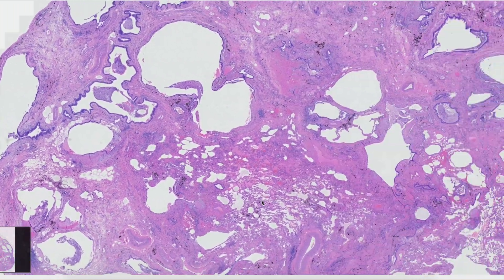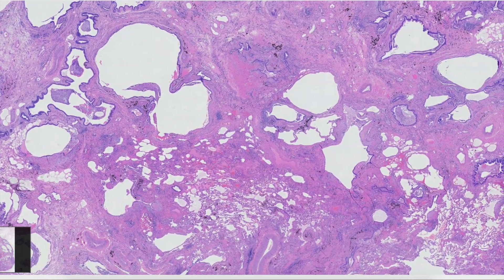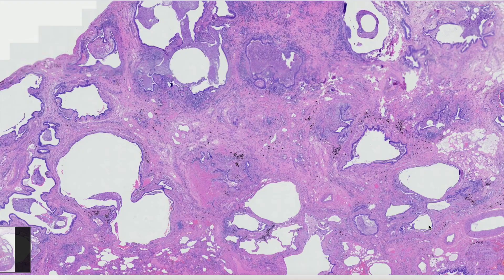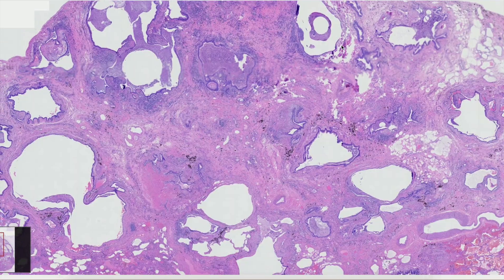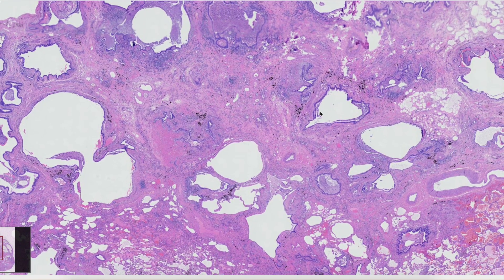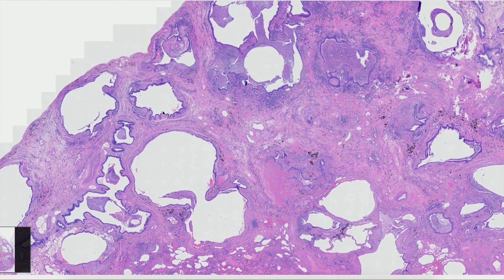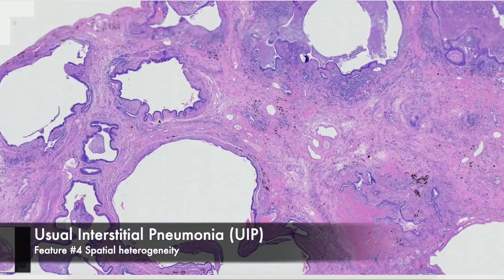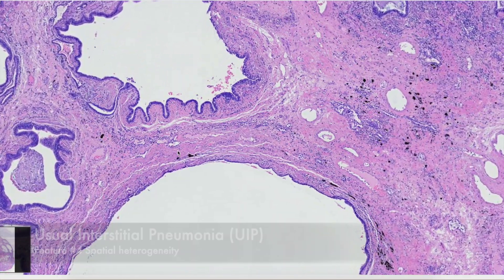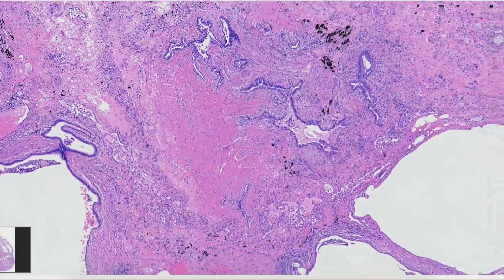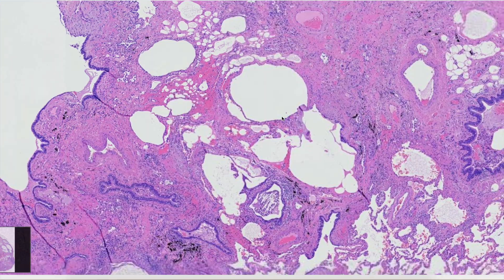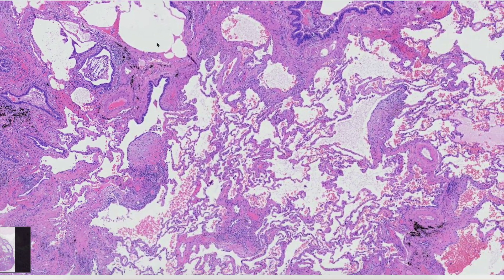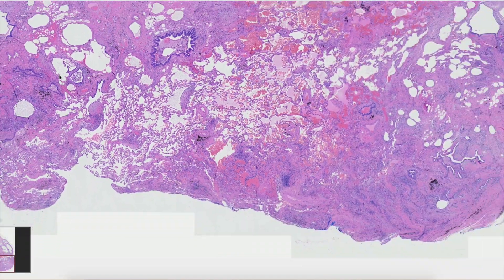As a pathologist, to make the diagnosis of usual interstitial pneumonia, what you really want to see is a patchy, heterogeneous process that is both spatially and temporally heterogeneous. Spatial heterogeneity means that one area looks very different from another, with uninvolved lung adjacent to active fibrosis.